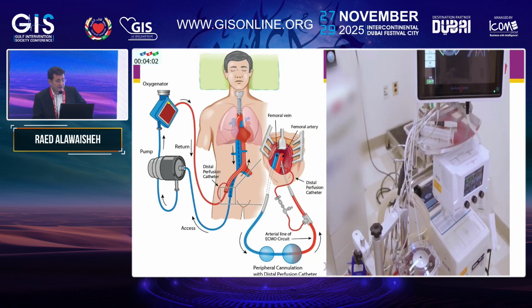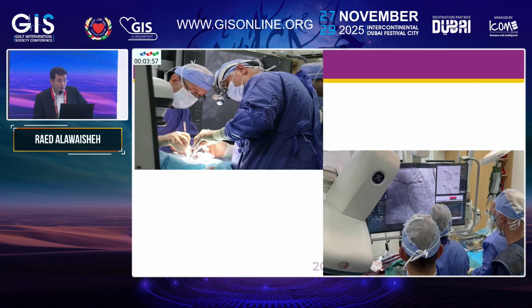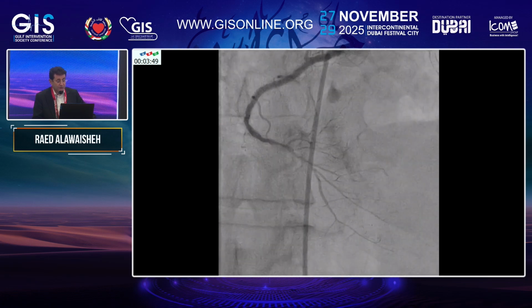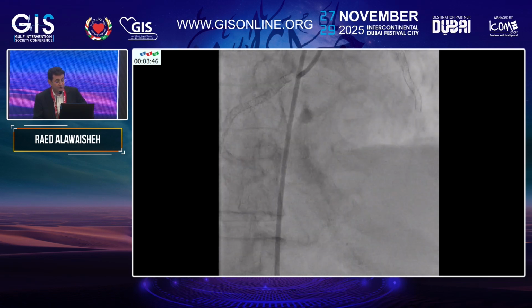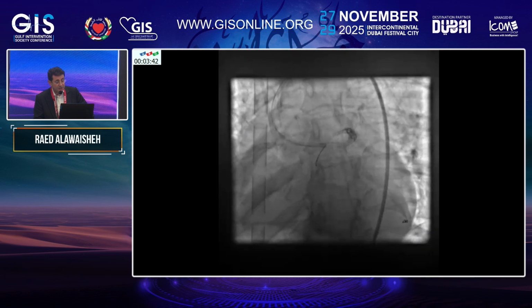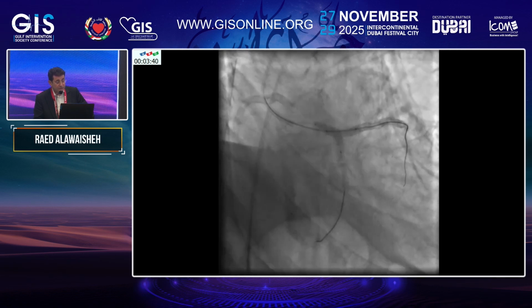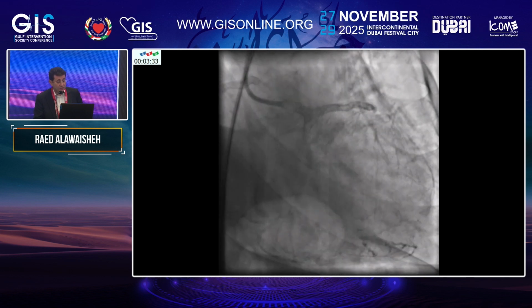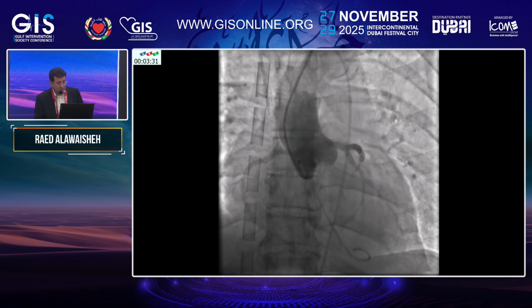As planned, anesthesia was started and ECMO initiated from the left common femoral artery and vein. The surgeon repaired the right common femoral artery where the sheath was implanted, and then we went to the RCA, fixing it with DCBs, and then the left main with the DK crush. You don't need these details. The result was good.